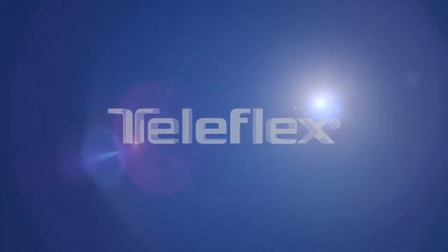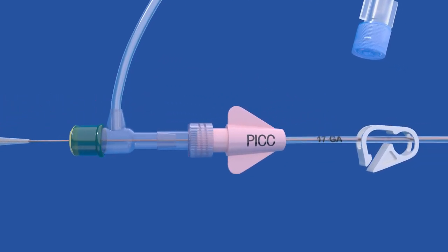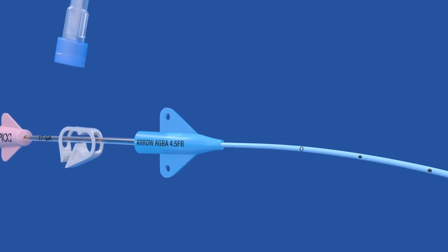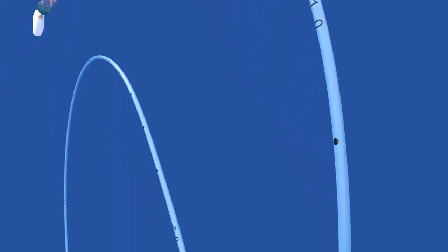Welcome to the Arrow Pick Preloaded with NaviCurve Stylet video experience. In this experience, you will discover how the Arrow NaviCurve Stylet, a component of the VPS Rhythm DLX device, offers an advanced tip location and navigation experience, enabling simple and efficient pick placement.